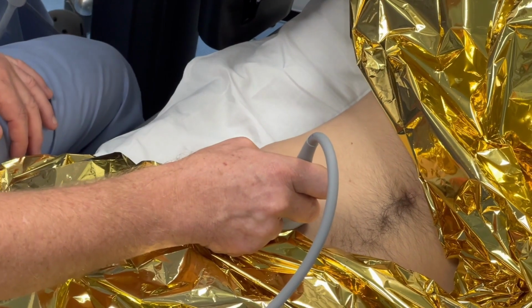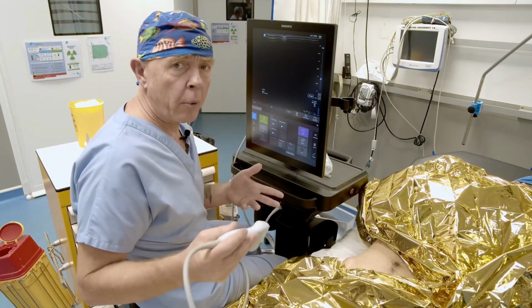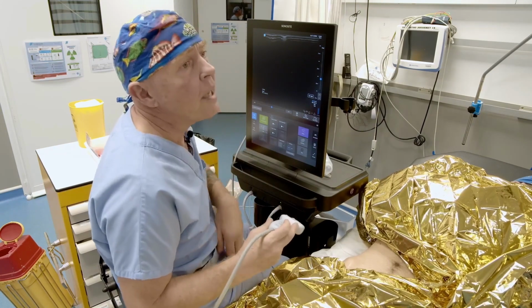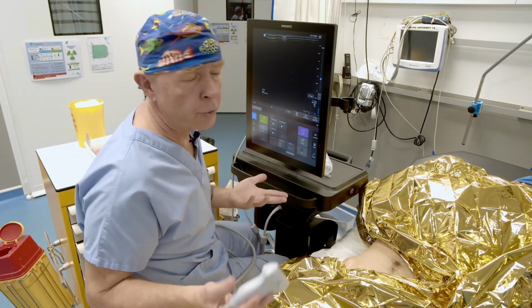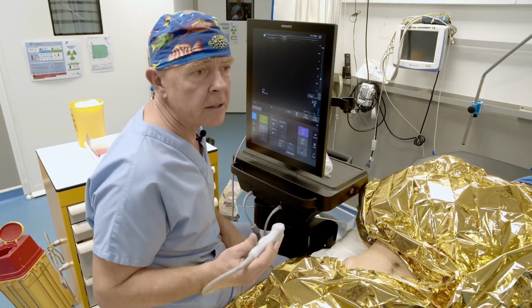So we're going to cover the last 2 blocks. We'll get set up again a bit for the TAP block and the paravertebral block. And with that, we'll have finished this workshop covering the 9 blocks. The main ones, namely the 3 blocks for the upper limb, the 3 blocks for the lower limb, and 3 diffusion blocks, which allow you to perform about 95% of your practice in anesthesia.